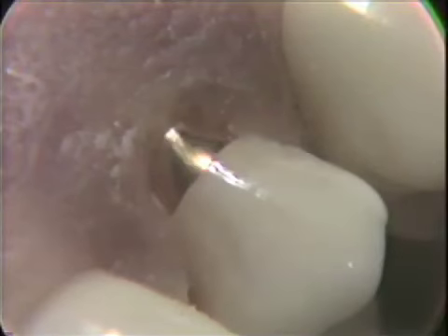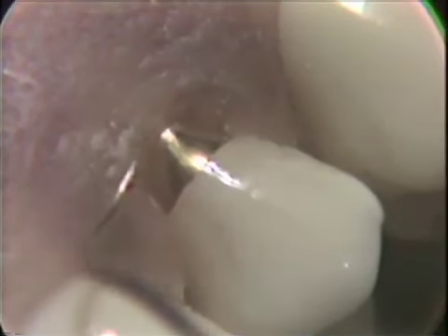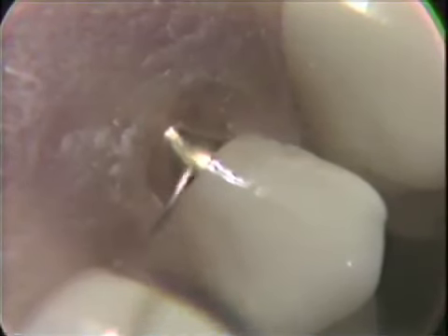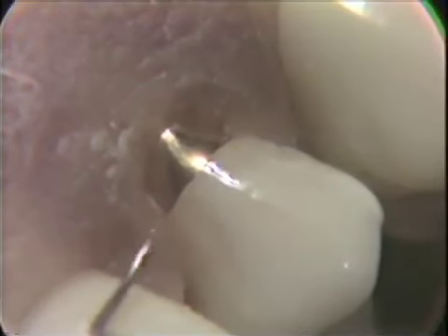We're now ready to do the removal of the rubber dam. The rubber dam now has been removed, which has allowed the gingival tissue to return to its preoperative state. We see again that the only visible margin is really the occlusal margin.